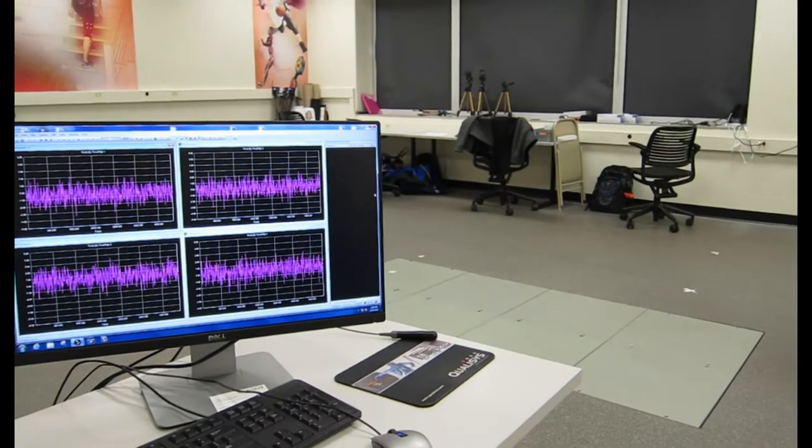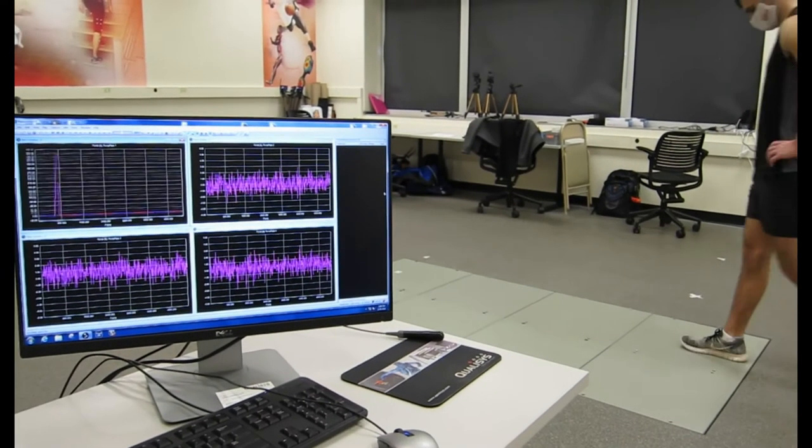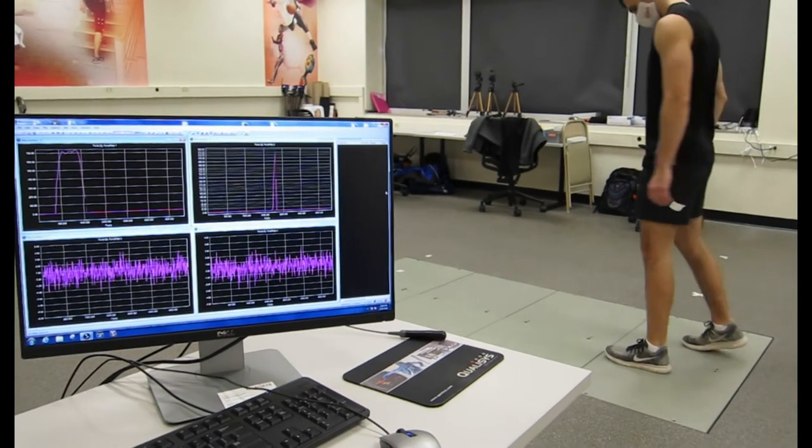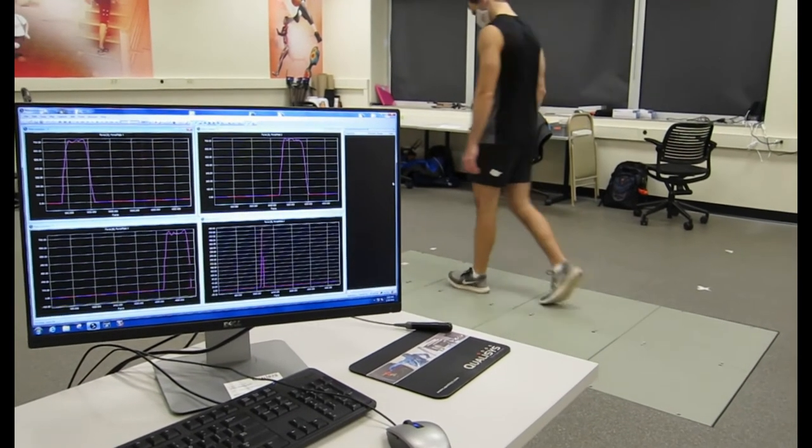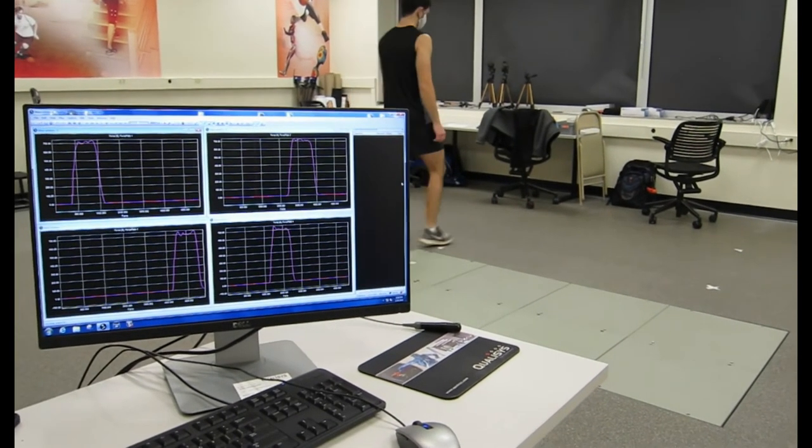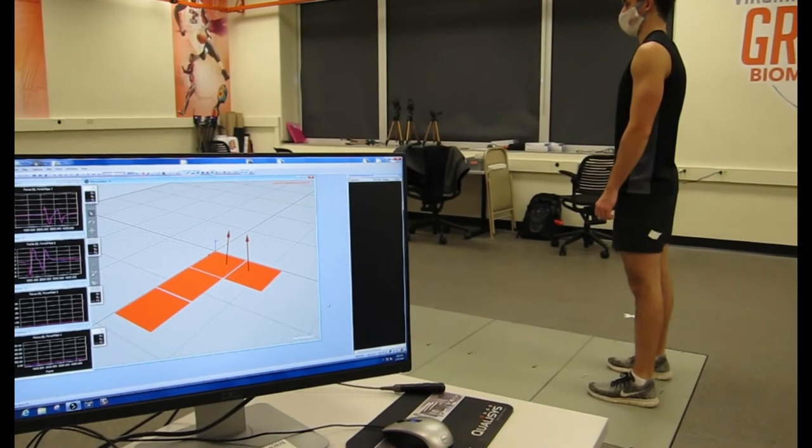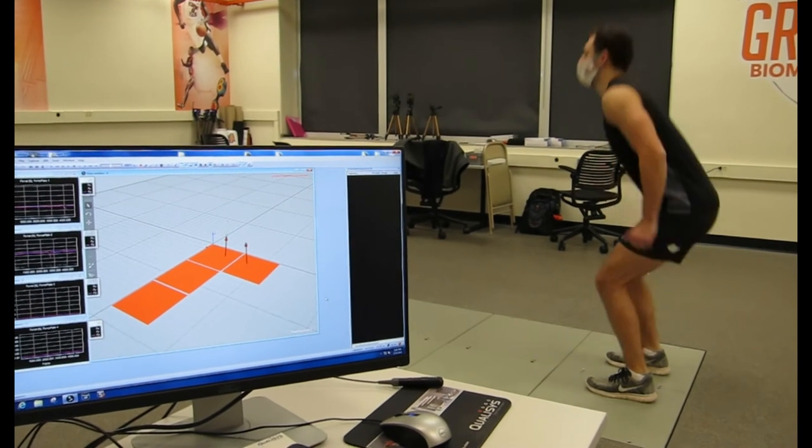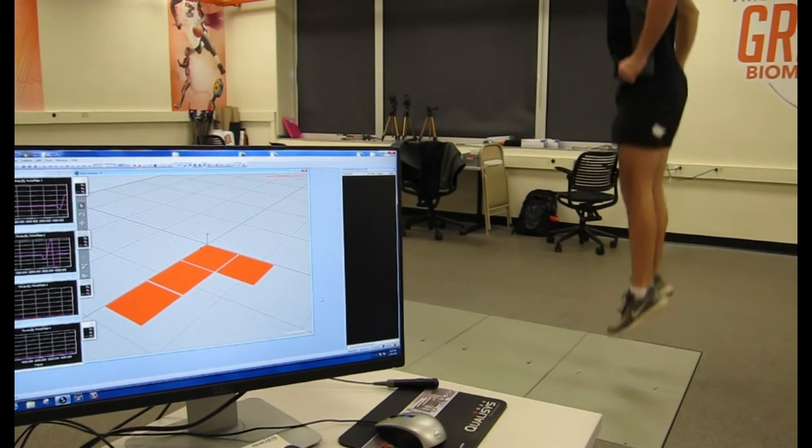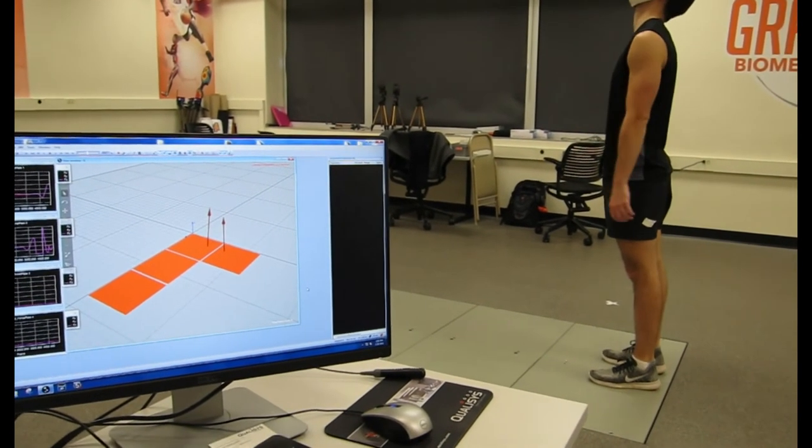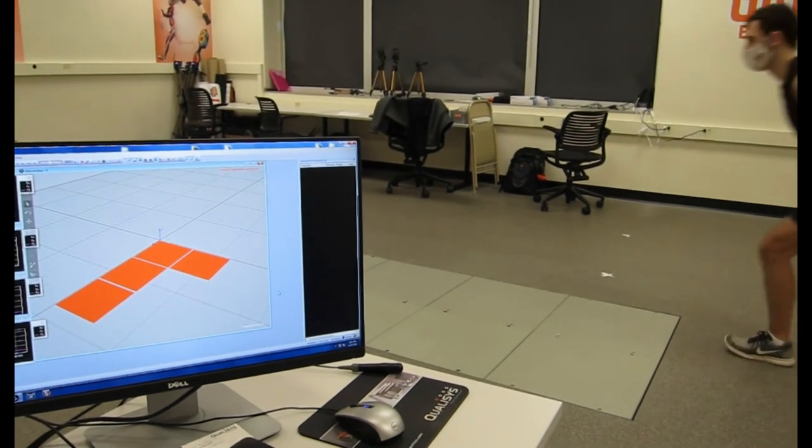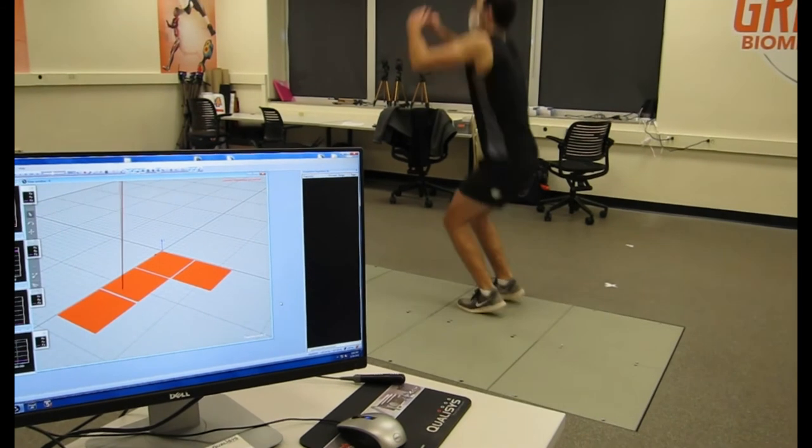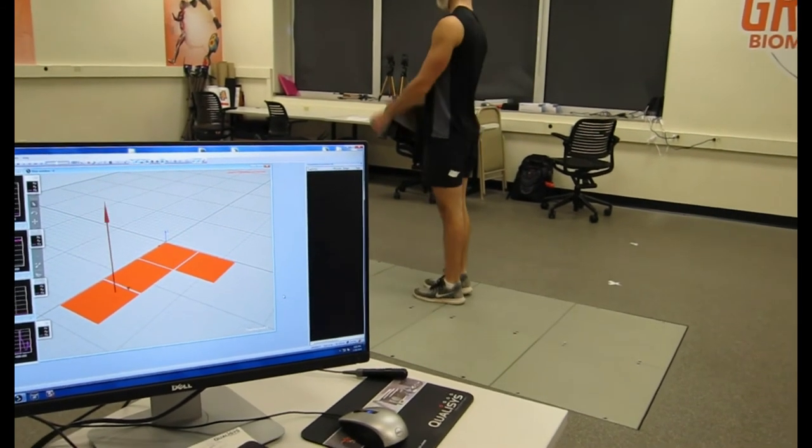An important measurement we can gather from these forces is the asymmetry of a person's gait or balance. This means we can see if a participant's left or right foot are applying the same amount of force. The more similar the left and the right side are to each other, the more symmetrical their gait or balance.